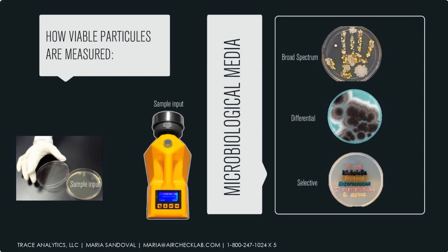If you grow an organism that makes secondary metabolites, what is a secondary metabolite? It is a product of the organism that acts to inhibit or increase the growth of another organism. So Penicillium is a fungus. It makes penicillin, which is an antibacterial. So broad spectrum has limitations. Not all the organisms could be captured on there. And so that's when you want to go into differential.